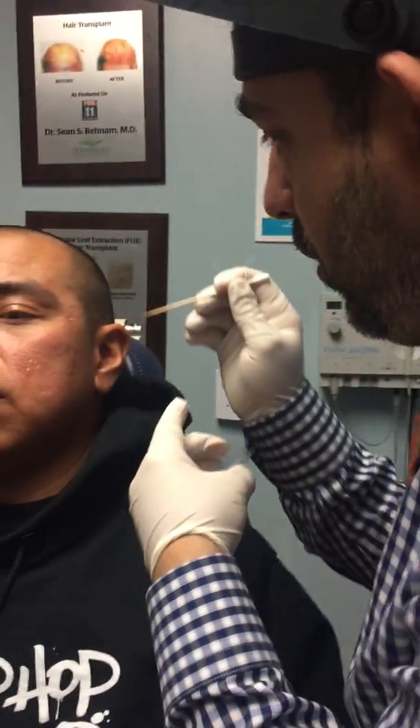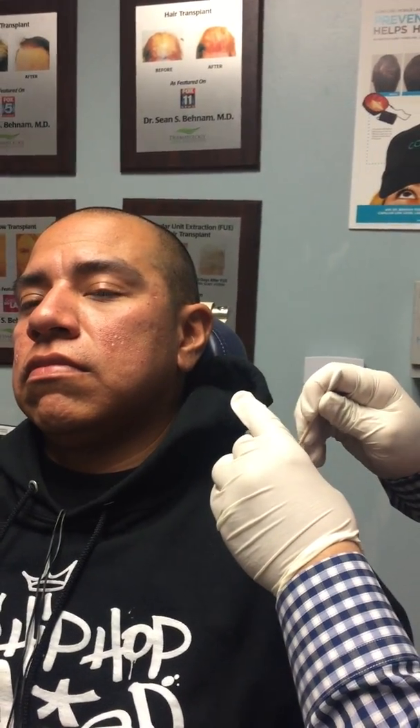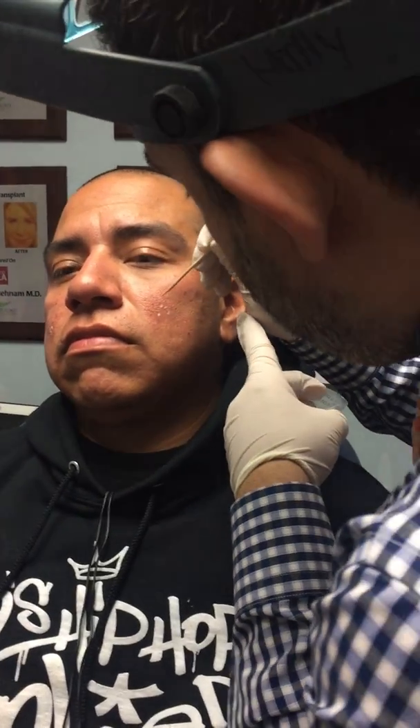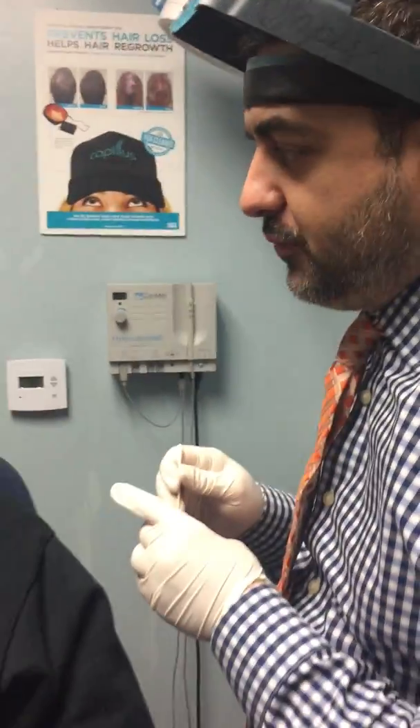TCA cross is a very safe technique. There are always two side effects that I warn my patients about. One is a risk of hyperpigmentation — that means adding more pigment. There's also a risk that the areas could become red after the procedure. You can see these areas frosting up. I like to repeat the TCA cross technique once a month, about three to four months in a row. On average, each person gets about 7% to 10% improvement per session, so if you do it three to four times, you're looking at about 30% to 40% improvement.